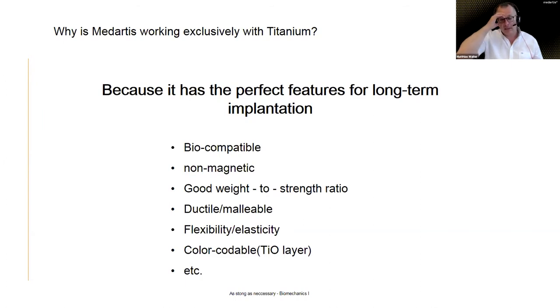But having said that, we're not alone on the planet. There are also other companies who will only work with titanium when it comes to implants. One of the reasons is it's a magnificent biocompatibility aspect. You can just leave it inside. Titanium will never cause... I should not say never, because this is a qualitative statement. In the majority of cases, it does not create any kind of tissue reaction.